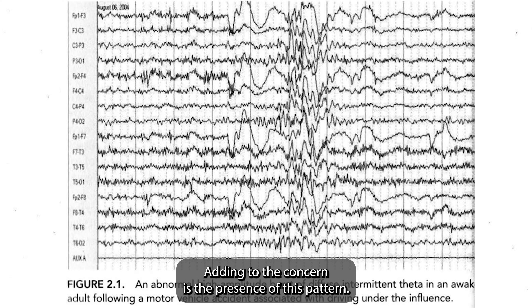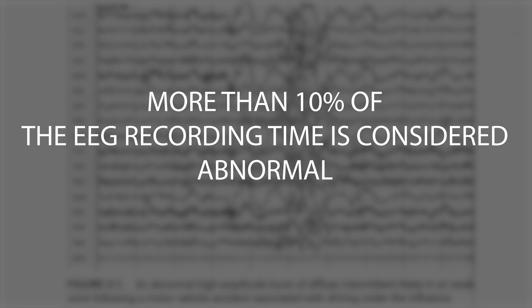Adding to the concern is the presence of this pattern in more than 10% of the EEG recording time, which was seen throughout this patient's 72-hour EEG.